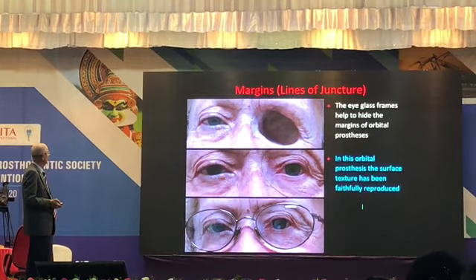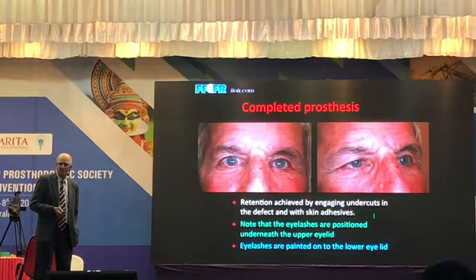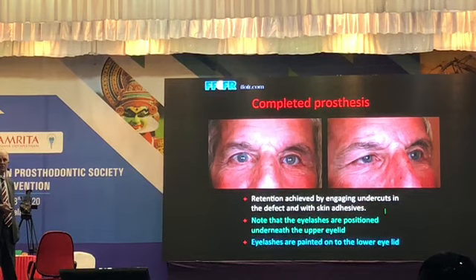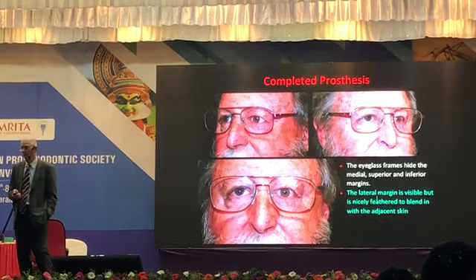And this is the Long Beach Grand Prix racing driver. So the eyelashes are painted on the lower lid, and synthetic eyelashes are used for the upper lid. Here's another. This is one of the residents' cases. One of our residents a couple of years ago did this case. A really nice outcome.